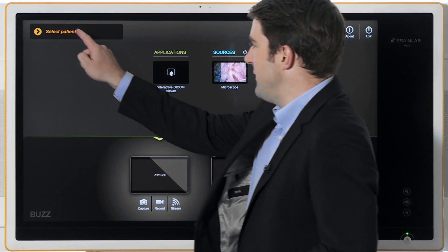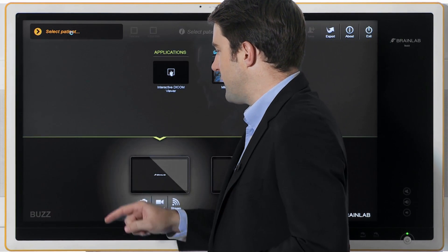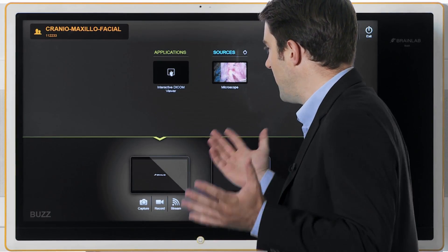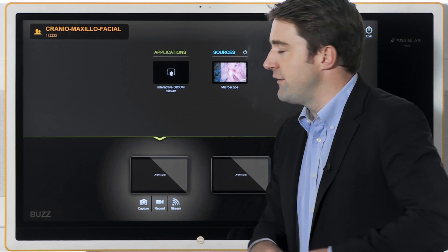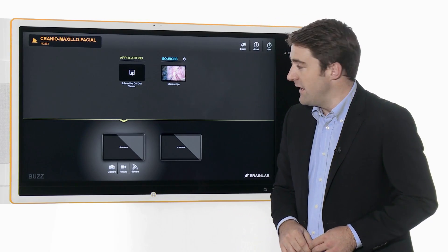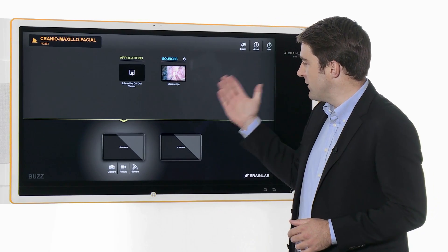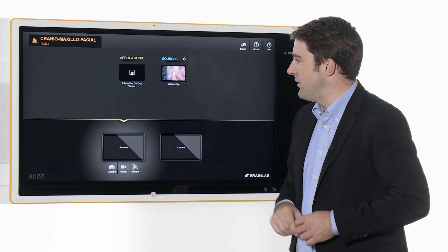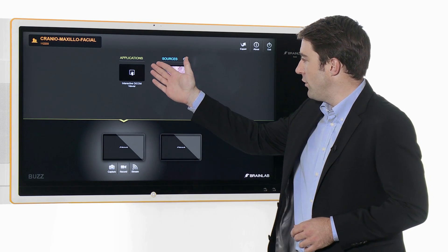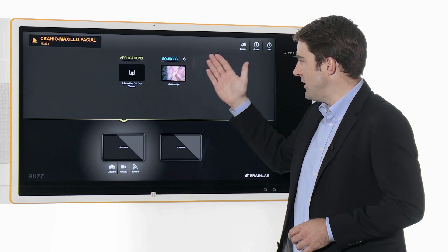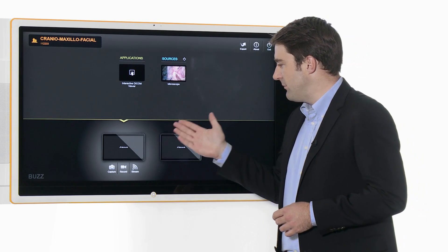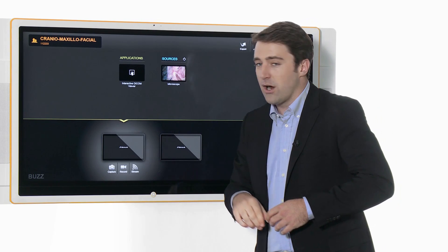To begin, the patient is selected from PAX or the hospital information system and all their pre-operative image data is immediately loaded. Everything on the screen is now linked to the patient. At the top, you have all available applications and sources, and at the bottom, all OR displays.